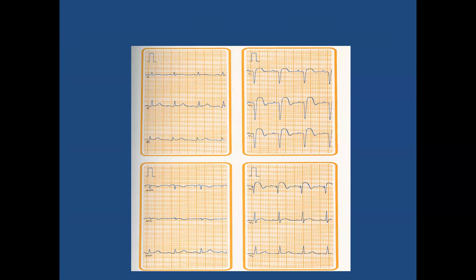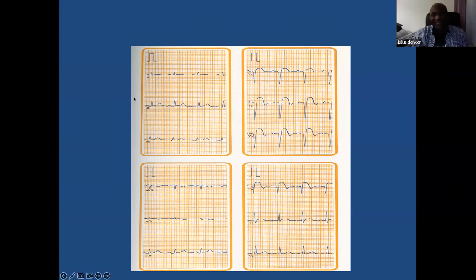It's a normal sinus rhythm. Excellent. That's it, with anterior MI. That's fantastic. Yeah, so that's what I want you to say. So preparing you for the IBHRE now.